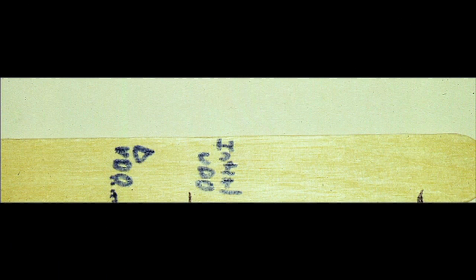So look at this. If we look at that tongue blade, once again, that's about a complete centimeter. And then you go into the whole mystery of, well, how did you open them up that much in that quick of a time frame? And I say, well, I really didn't open them up that much. To me, this patient has been over-closed for too long of a period of time.